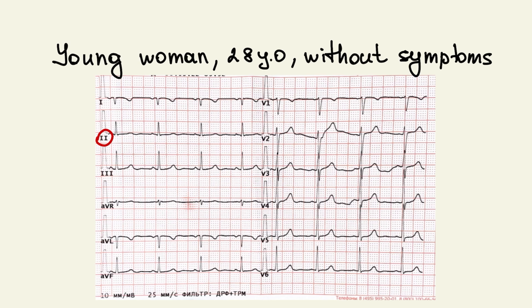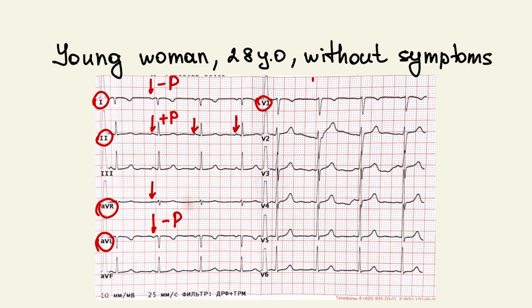Look at lead 2. The P wave is positive before every QRS complex, but we don't see a negative P wave at lead AVR. This is unusual and not typical for sinus rhythm. We can see a negative P wave at lead 1, AVL, and at lead V1. At lead 1, the P wave should always be positive in sinus rhythm, but here we see a negative P wave.